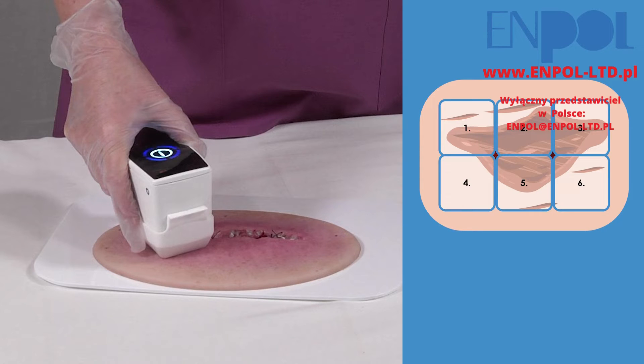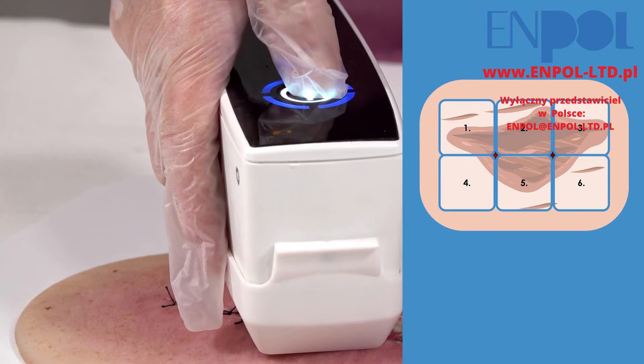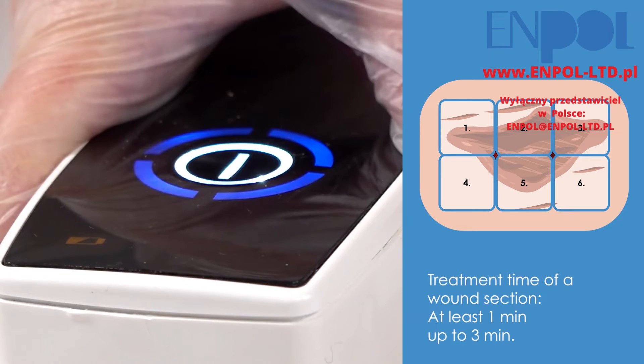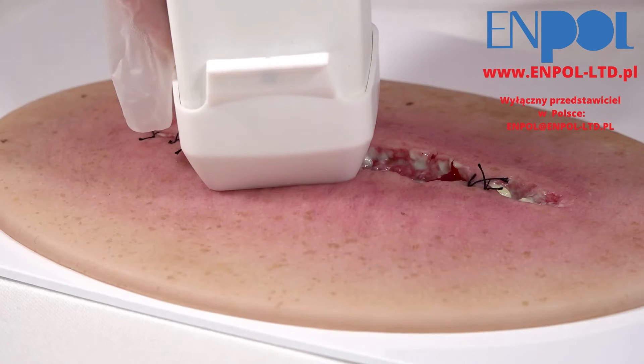For larger wounds, you can perform up to 6 of these cycles on different wound sections within a time window of 10 minutes. For this purpose, the PlasmaCare is positioned on the next wound area and the treatment starts again when tapping the touch button slightly.